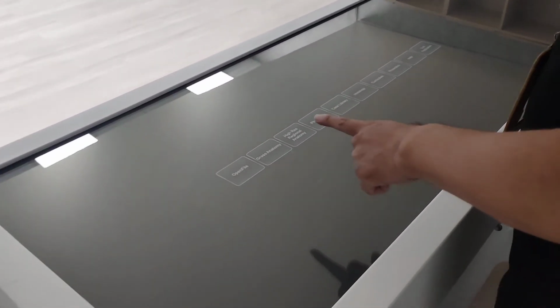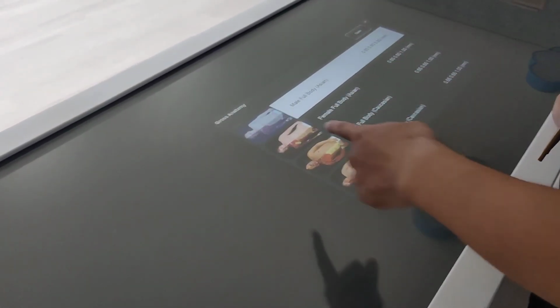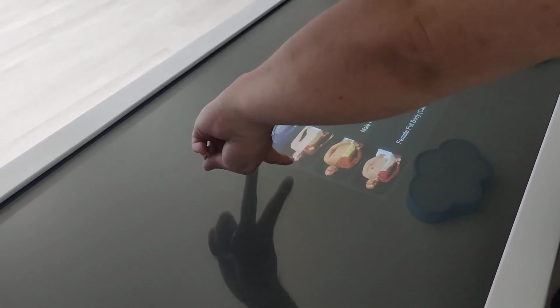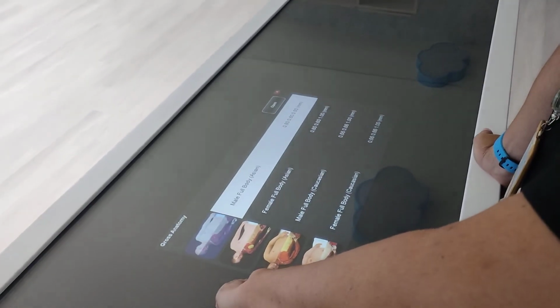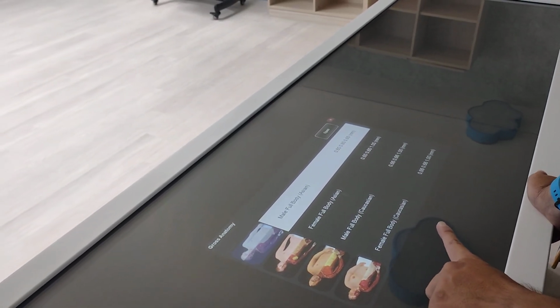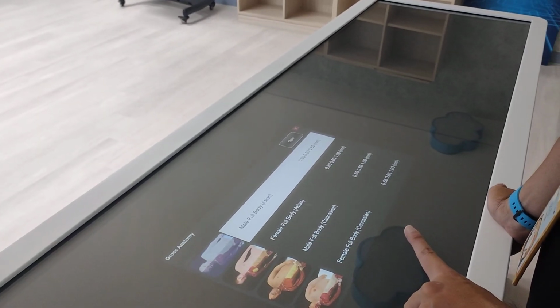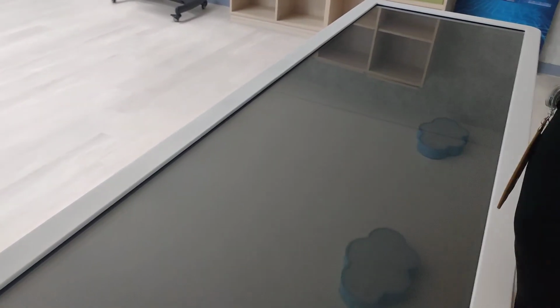Okay. So the second one is the gross anatomy. If you press it, you can see 4 cadavers. Okay, and the first two are Asian, and the next two are Caucasian. So male, female, male, female. Which one do you want to open? Choose one. First one. Okay, always.